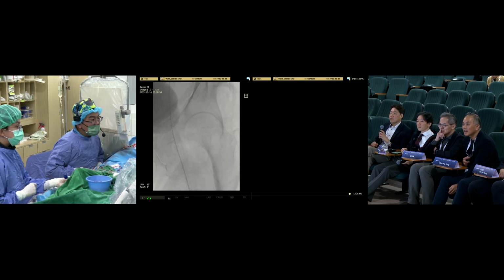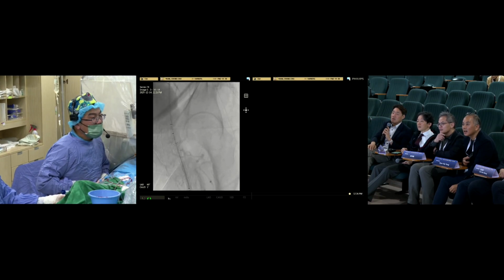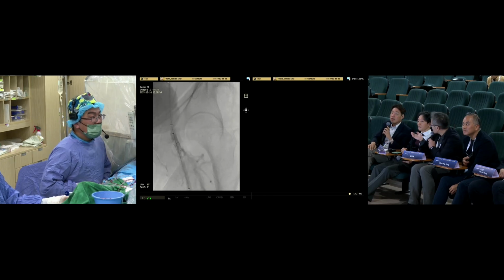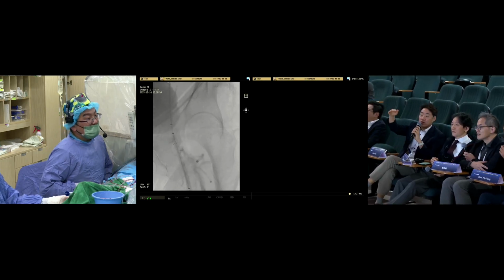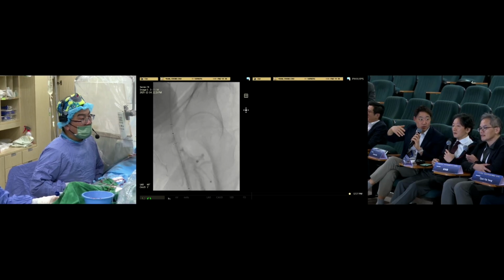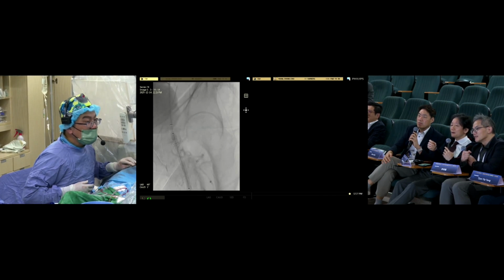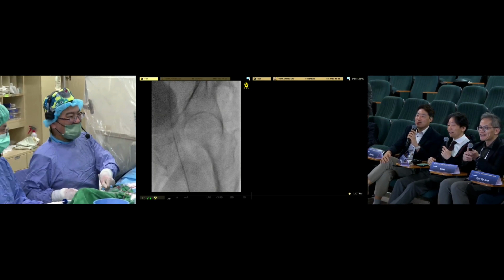Does everyone think it's okay, this location? Or should we go higher, angle a bit, do you think? Dr. King, is this a good position for the stent? I think I want the stent a little bit further down. It's a little too high in my opinion. But what about Dr. Soka? Yeah, I think so. A little bit going down, maybe just half, 5 millimeters. So I'm halfway between now and the previous stent, I think.